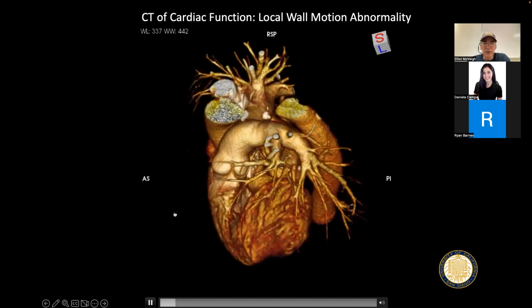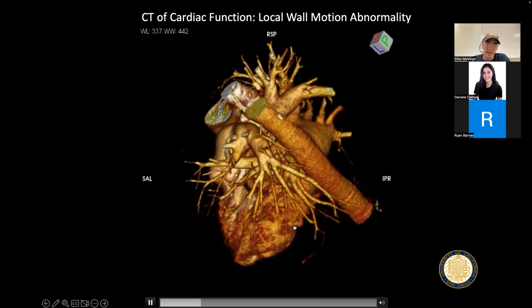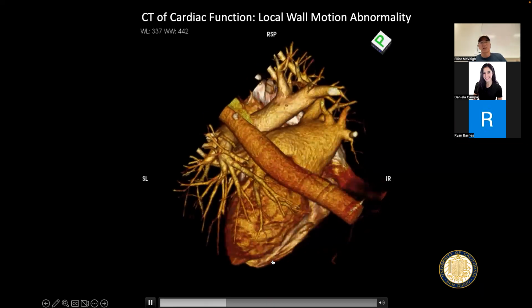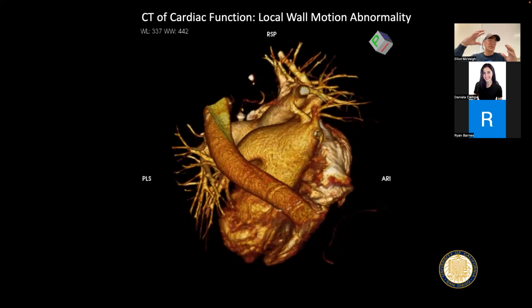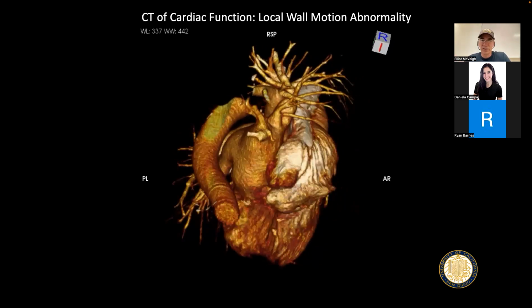However, what usually happens is tissue dies right to the edge of these things, and if you have an infarct, it looks something like this. It's something that has a distension. Usually it's bulged out and it doesn't squeeze down, and so the features don't contract.